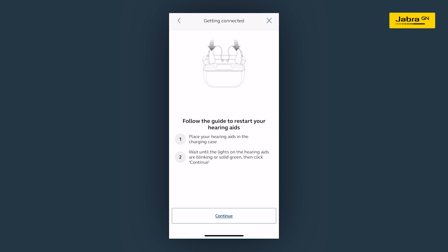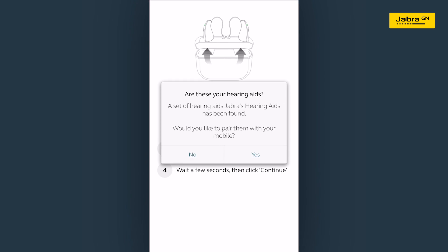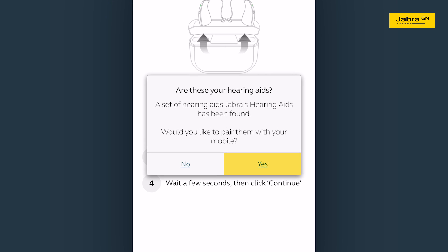You will be asked to restart your hearing aids by following the guide as shown on the screen. After the hearing aids have restarted, the app will automatically start searching for your hearing aids. When found, you will be asked to confirm — tap yes.